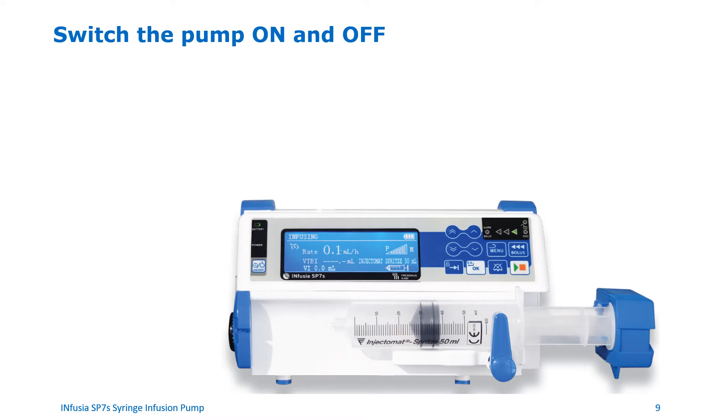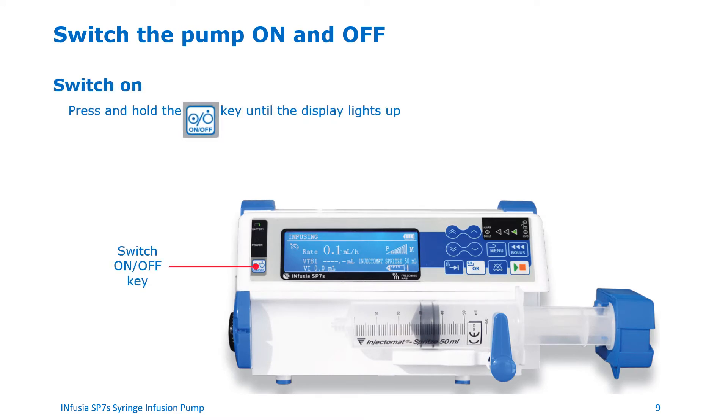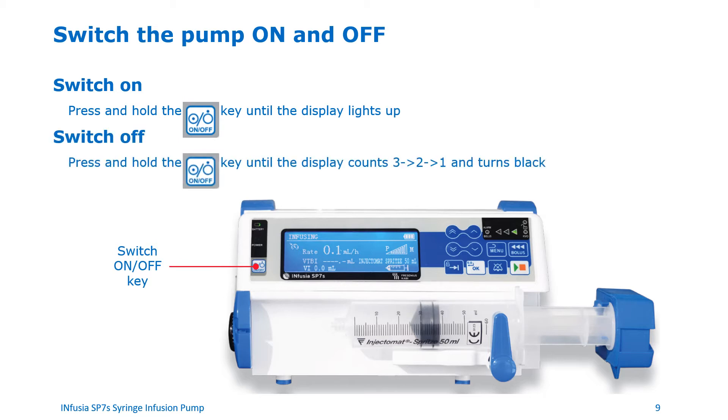Now let's see how to turn the pump on and off. To turn the pump on, press and hold the on-off key until the display lights up. To turn the pump off, press and hold the on-off key until the display counts down three, two, one, and turns black.